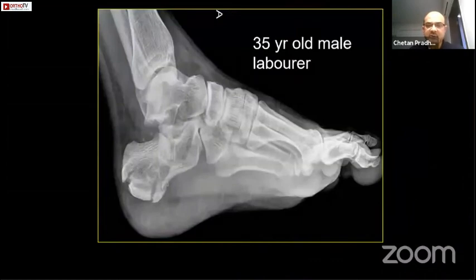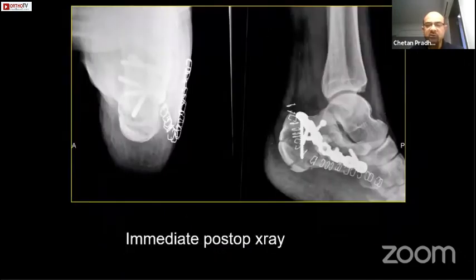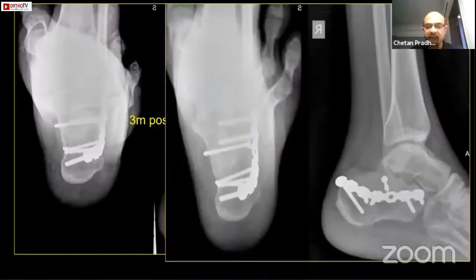Another example: a 35-year-old laborer, fall from the first floor — a severely comminuted fracture. I don't have the CT scans right now, but it was a very comminuted fracture. He was a very poor laborer who could not afford any other implant, so I had to use a simple reconstruction plate contoured. This is how it has been reconstructed — immediate post-op, three months post-op, and one year later. I would always prefer using an interfragmentary screw in the posterior facet and then neutralizing the whole thing with the plate. This is one year post-op.